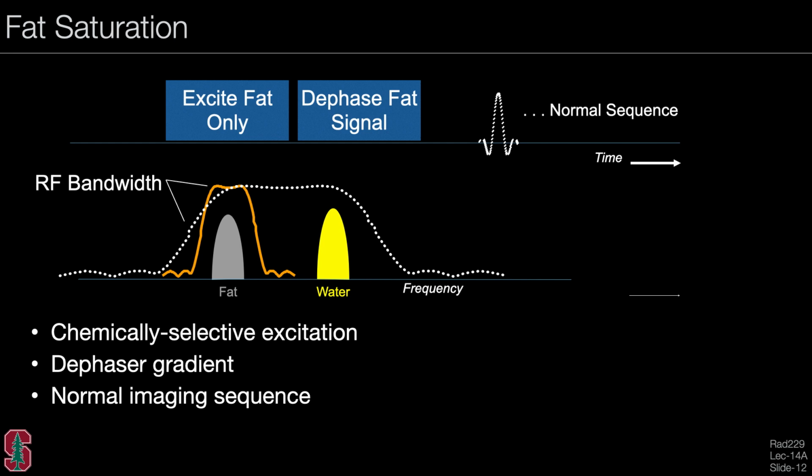And then we can go about our normal sequence playing a wider band pulse that would otherwise excite both fat and water. This is a shorter pulse, so we can go about our normal imaging sequence quite efficiently. So this is the approach for fat suppression.